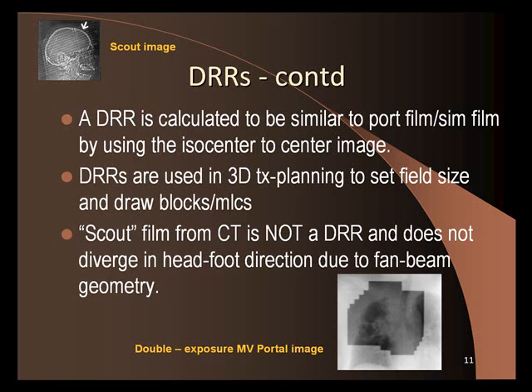And so all the photons scatter equally, and so they don't give you any contrast. So you're using MV, so it makes it blurry, but still you can make out some anatomy. So you can make out lung in this case, and right here you see the airway. This bifurcation right here is called the carina, so we use that a lot as a landmark.